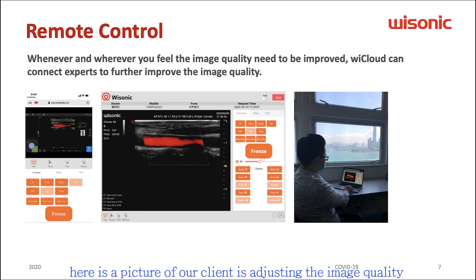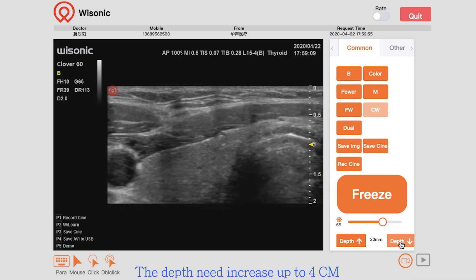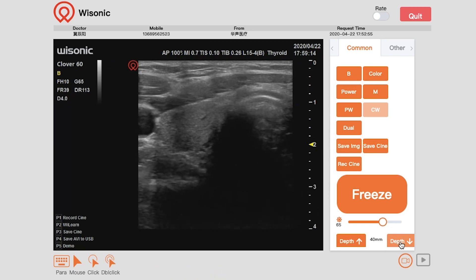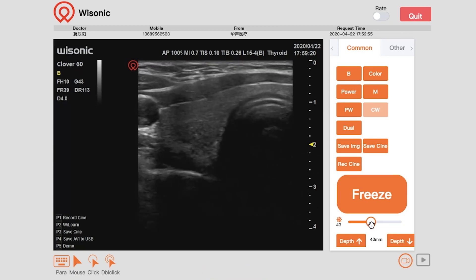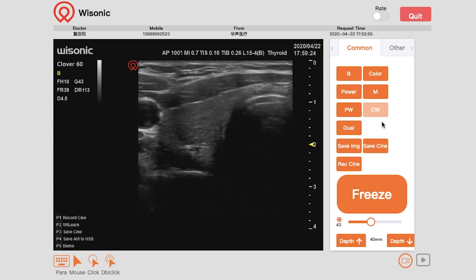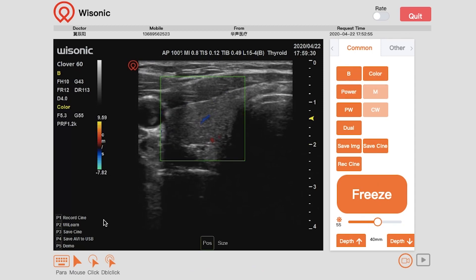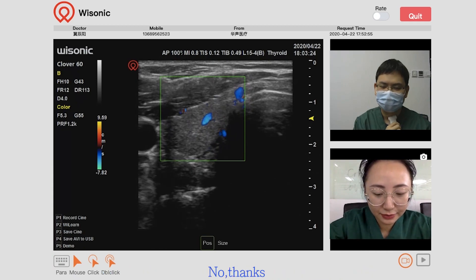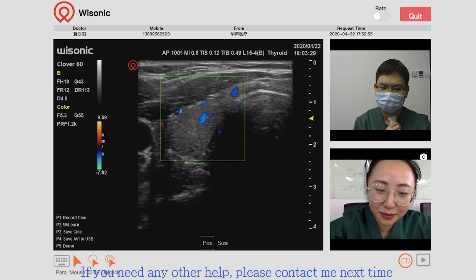Here is a picture of our client adjusting the image quality of a machine in mainland China while sitting in Hong Kong. The depth needs to increase up to 4cm and the gain should be decreased. Once done — that's right. Do you have other questions? No, thanks. If you need any other help, please contact me next time.